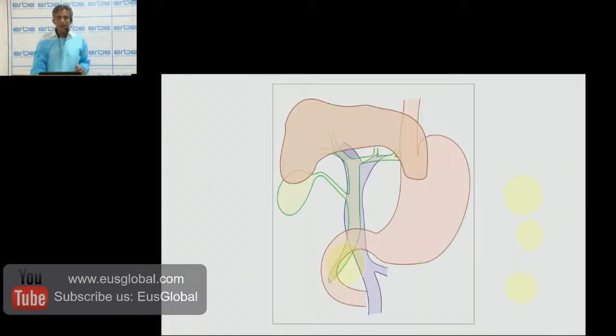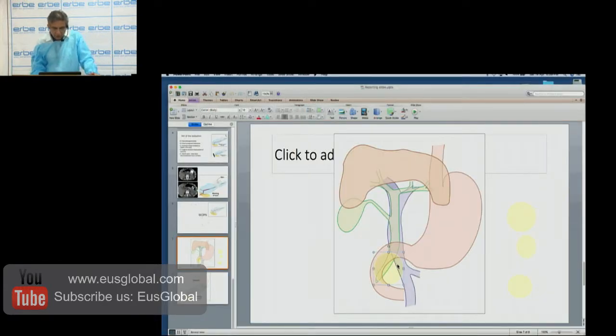So the second part I would like to show is this figure. We can make it bigger, and this is the tumor. We want to show that the tumor is here, here, here, and where exactly the tumor is. We want to show where exactly the tumor is and how big the tumor is.